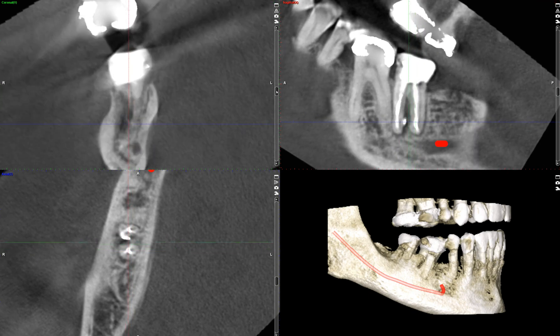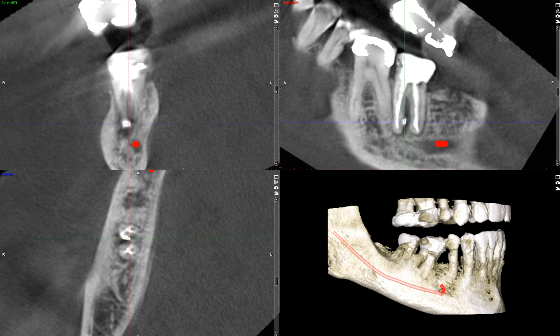So the question is: what is this? I think it's fairly clear that this is filling material, given the same radio-density we see with the endodontic material — presuming this is gutta-percha or sealer.